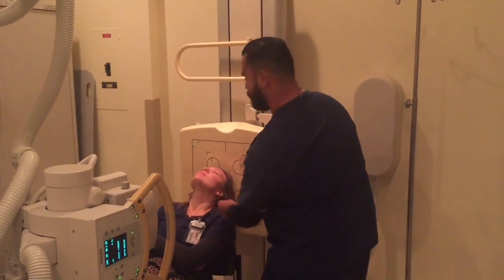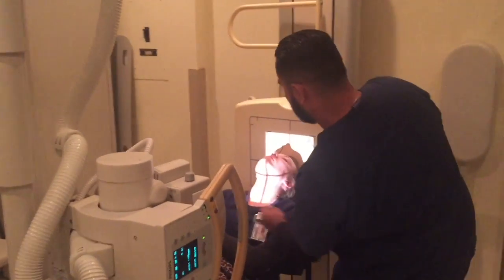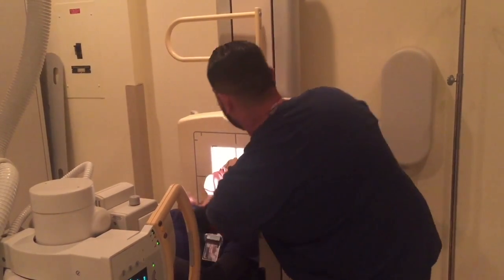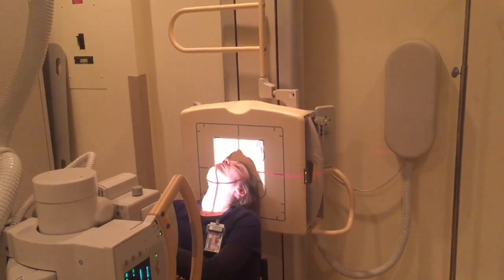So I'll be leaning your head back, please. Slightly this way. Just okay, stay like that, don't move, don't breathe. X-ray.